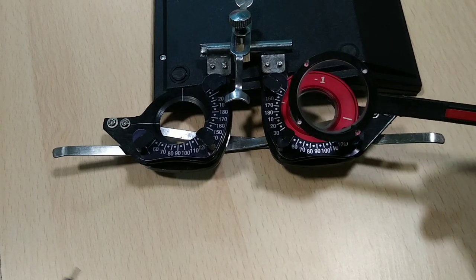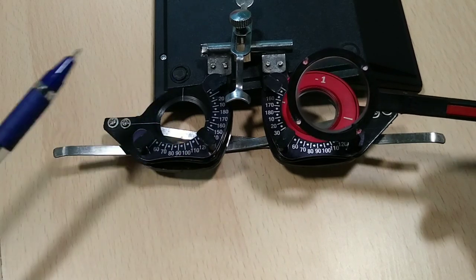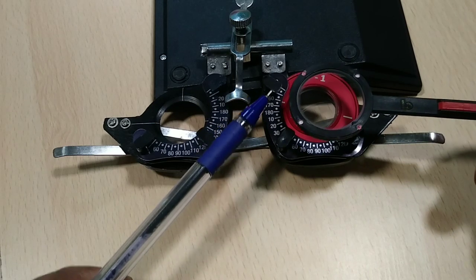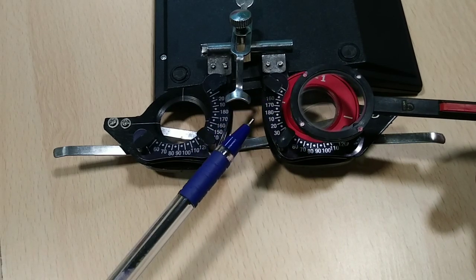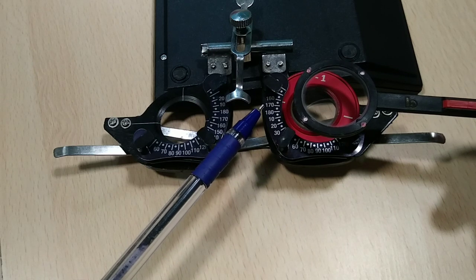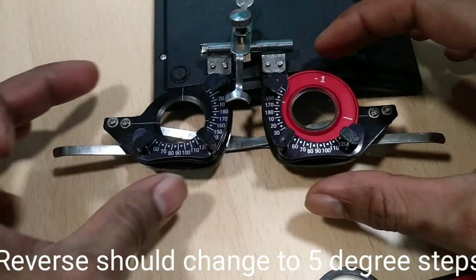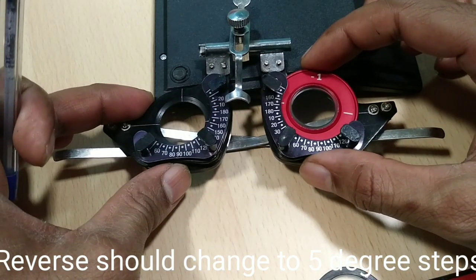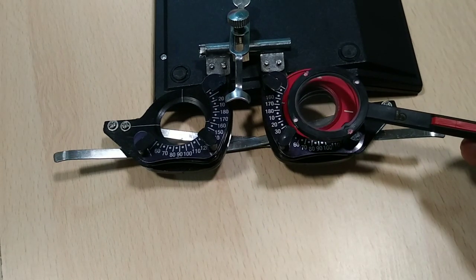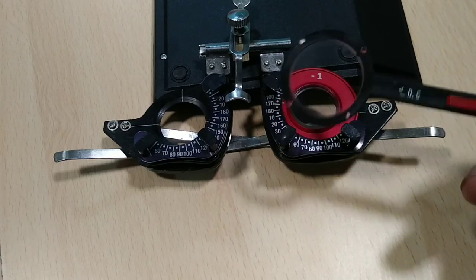Each time the patient responds, move 10 degrees toward the minus side. However, when the patient reverses their response — saying the other side is better — you do not go back a full 10 degrees. Since you already checked 170, go instead to 165, halfway between. The patient should respond consistently if your subjective refraction is correct, and 165 becomes the refined axis.